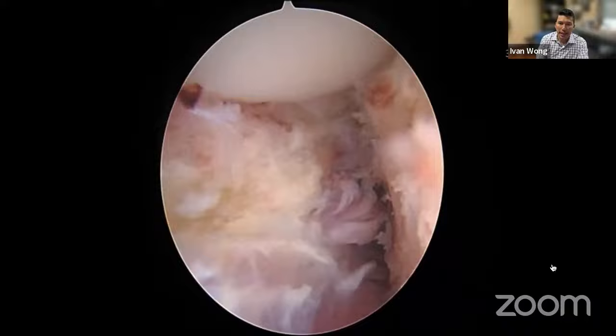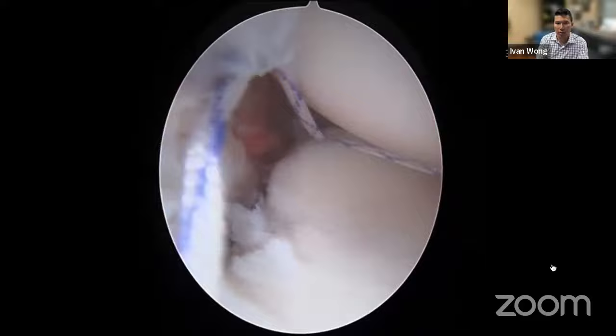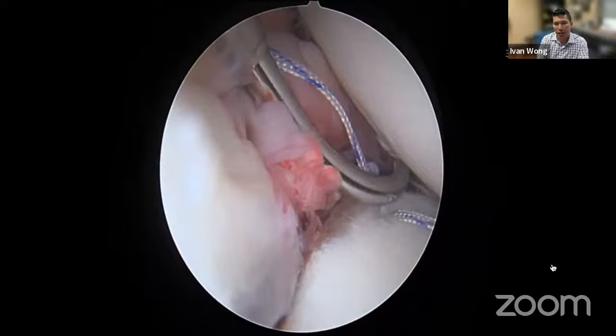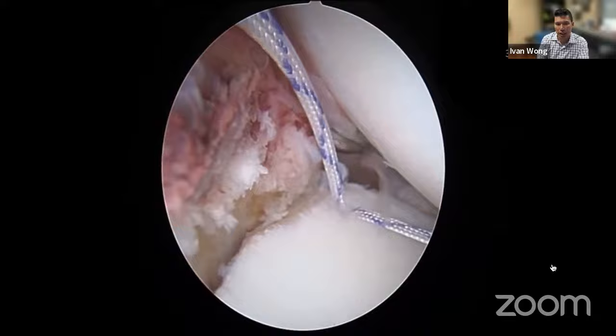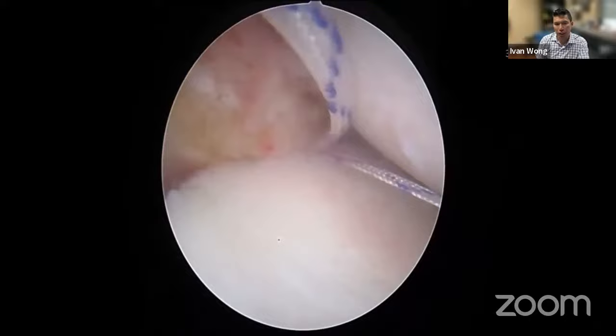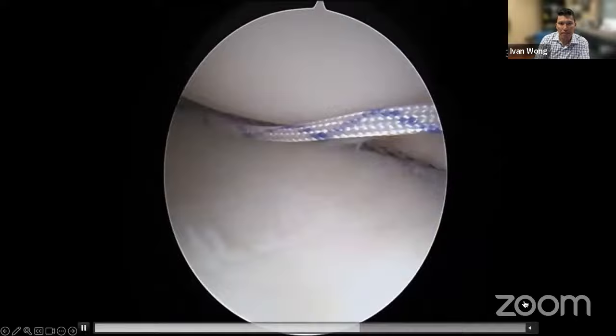We pull the head back and use the anterior inferior portal for our suture passer device. Critically, we also put tension on the traction stitch — remember it was grabbed at three o'clock. Once in position at the anchor site, I pull on that traction stitch, and with the tension on the capsulolabral complex I'm able to circumferentially grab all that tissue. I'm at the junction between the capsulolabral complex and the periosteum and muscle belly, which is right below — getting a better, thicker grab of tissue thanks to the periosteal tissue included.